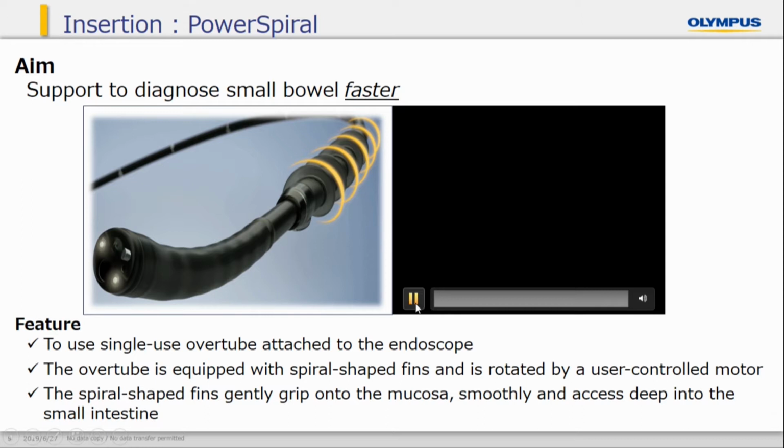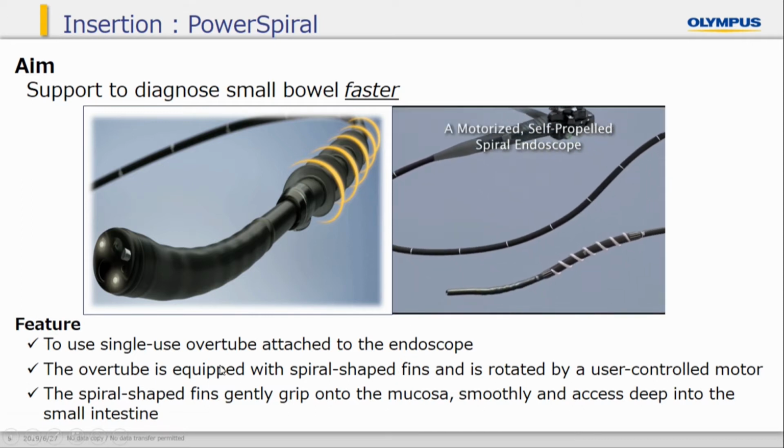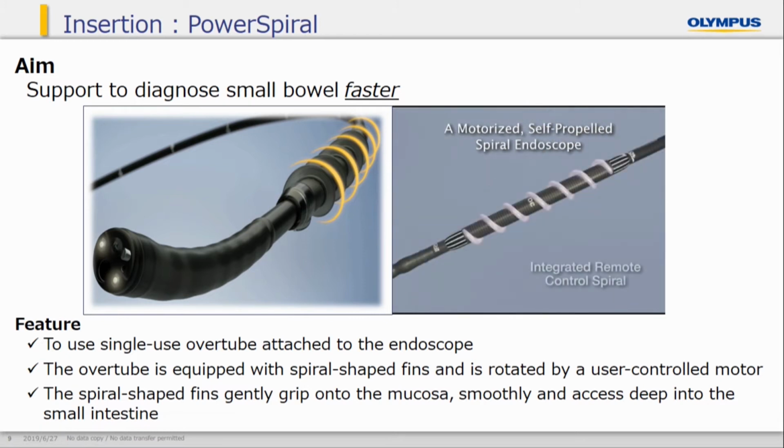As you can see in this movie, the feature is to utilize a single-use equipment with spiral shaft fins that is rotated by a user-controlled motor.